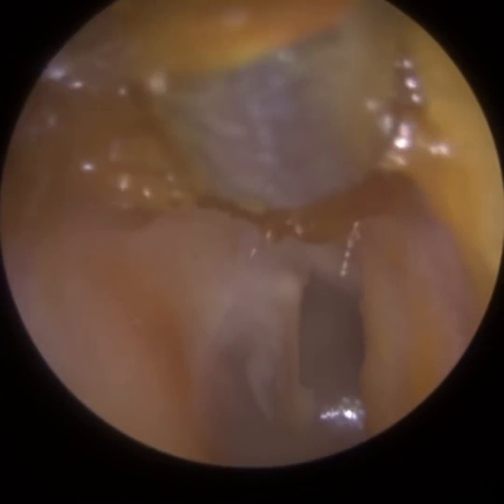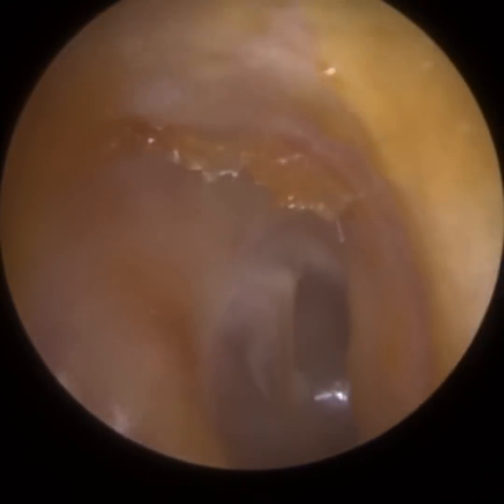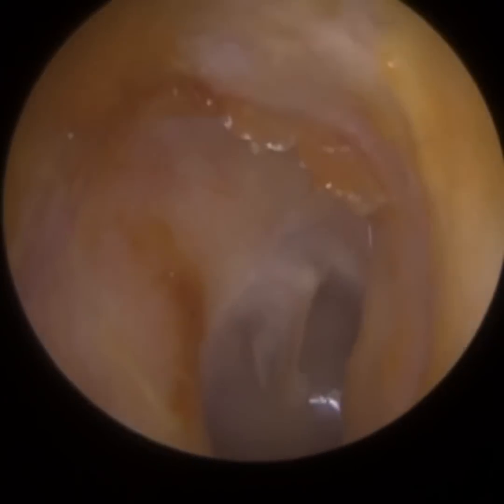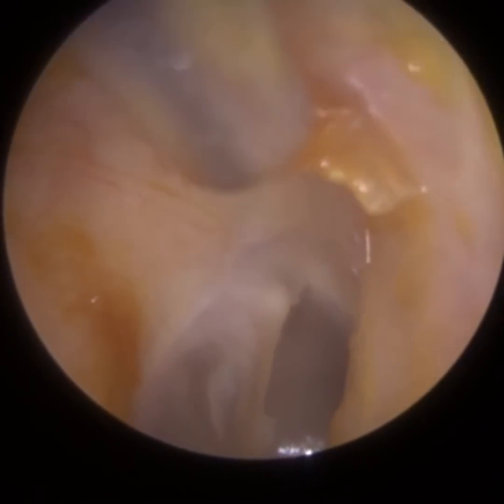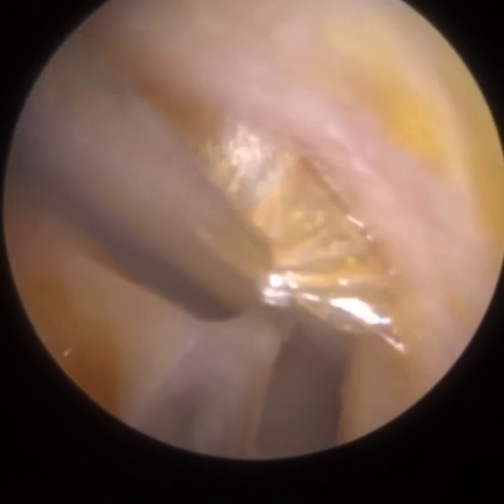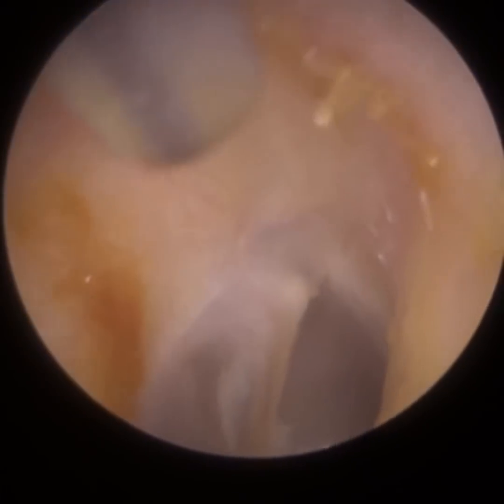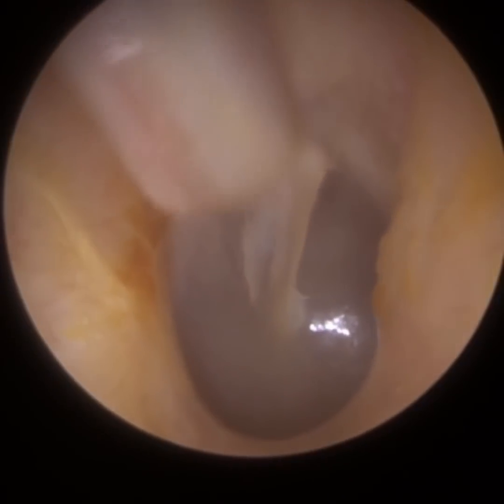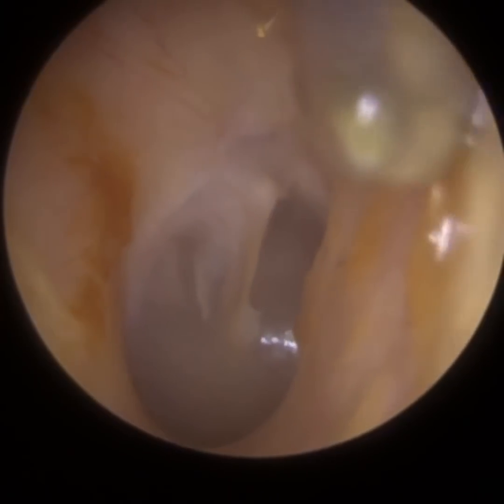So this is the patient's right ear. This patient's head is tilted over towards their left shoulder, so their right ear is facing more towards the ceiling. For me to get access, obviously, I then need to be at a higher level. And when you've got oil in the ear at the same time, you can get a bit of blurriness, because as you're suctioning the oil, it does bend some of the light rays from the endoscope.